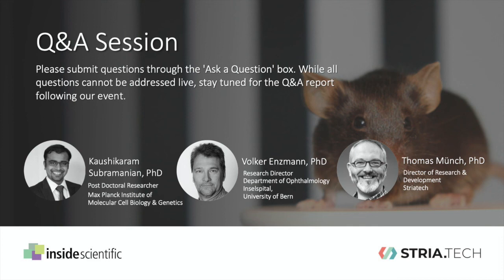And second, an experienced observer has, as I said, experience, and that means even when the experimenter is blinded, he or she becomes biased during the measurements, and somehow can already, by looking at the animals and their movement, anticipate the expected outcome.